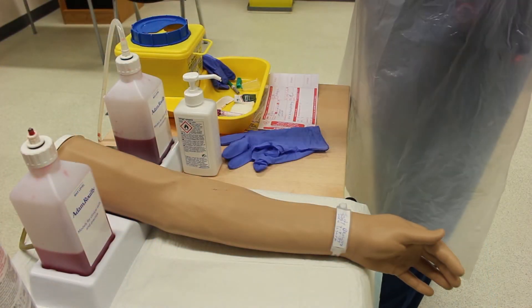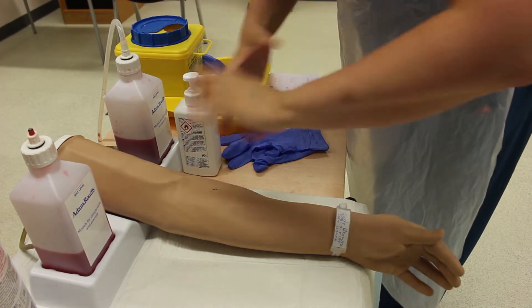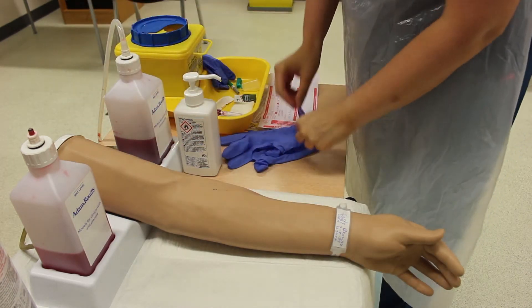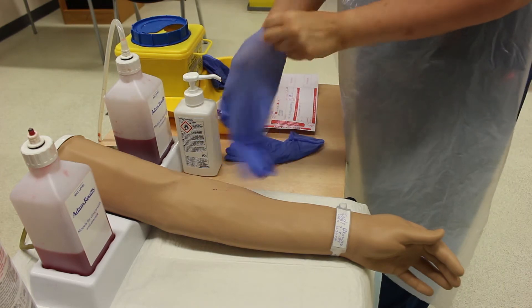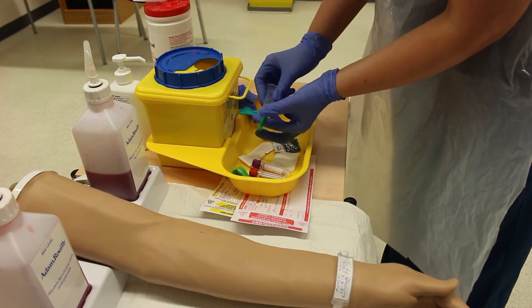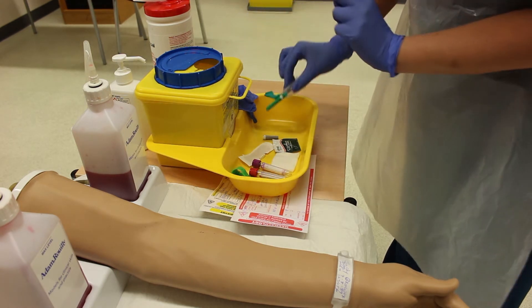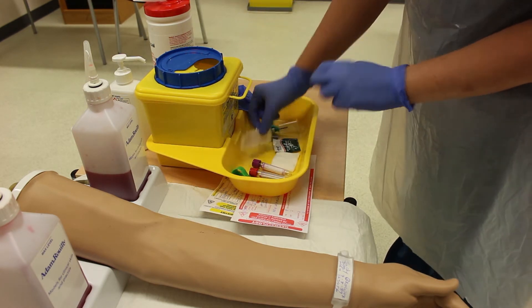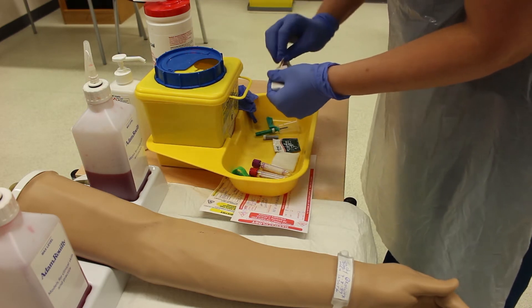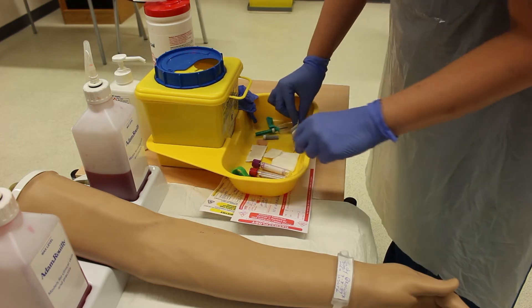Follow your local policy for infection control. With my gloves on, I'm preparing my needle and vacuette holder. I'm protecting the key parts — leaving the cap on the needle so it remains sterile. Using ANTT — aseptic non-touch technique — I'm opening the other pieces of equipment, taking care not to touch the key parts.